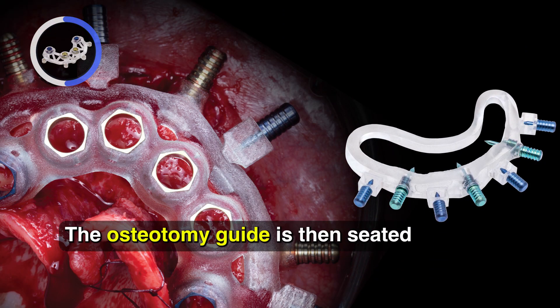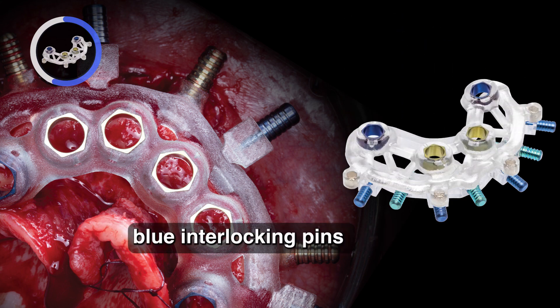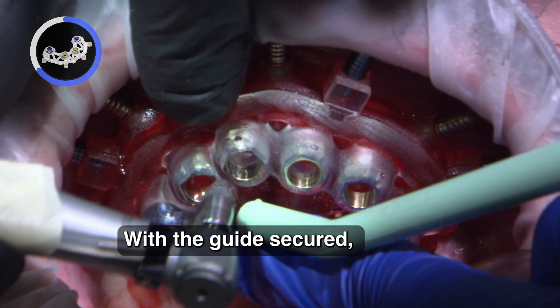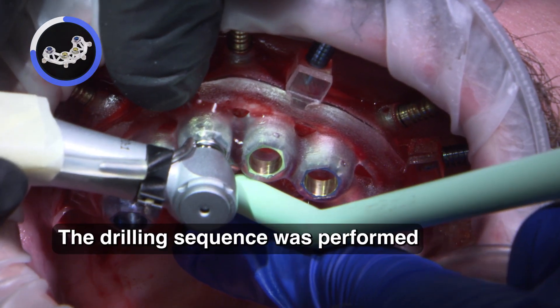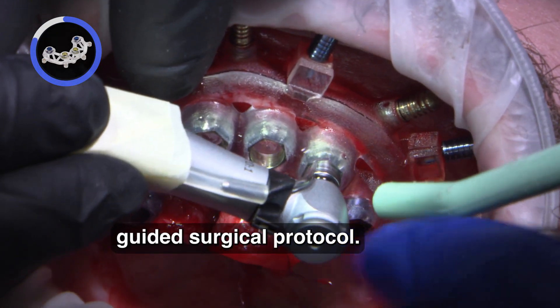The osteotomy guide is then seated on top of the foundation guide and the same blue interlocking pins are reinserted to secure this portion of the guide in place. With the guide secured, the osteotomies were sequentially drilled following the approved digital treatment plan. The drilling sequence was performed according to the pre-planned guided surgical protocol.